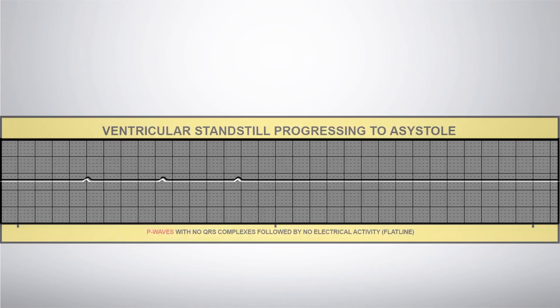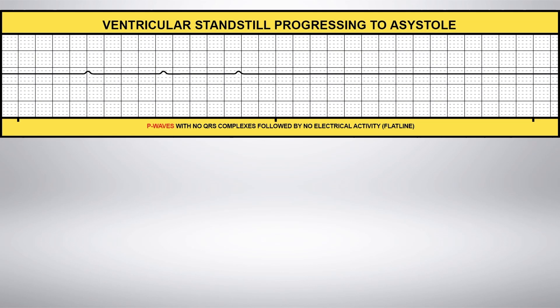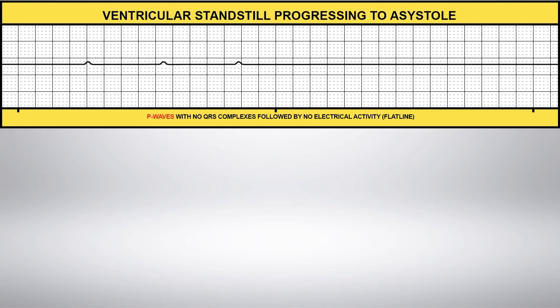What is your interpretation of this EKG rhythm strip? Ventricular standstill, progressing to asystole.